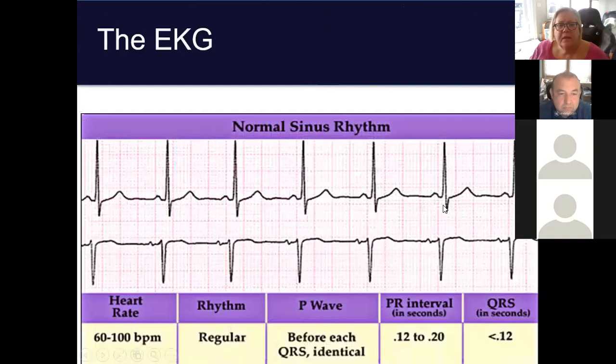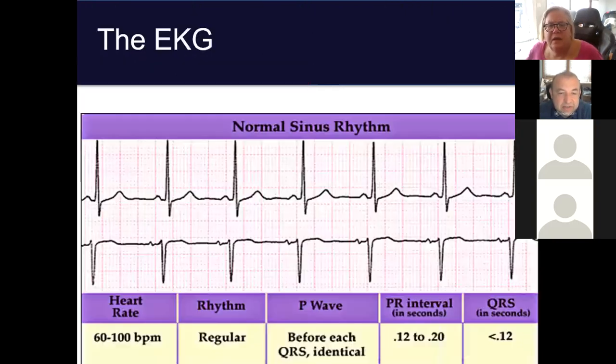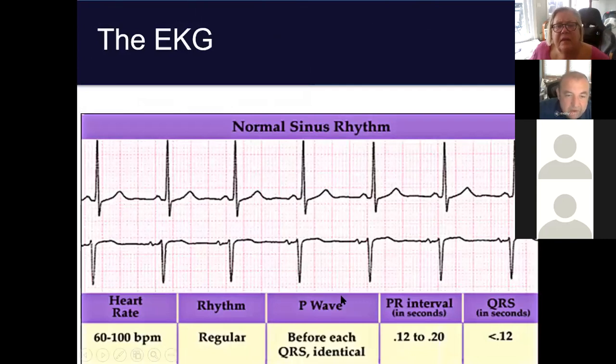All right, so here's normal sinus rhythm. Again, well, maybe that's V1. I was going to say V1, one of the V leads. Yeah, because we'll show 12 lead. We'll show our wave progression, right, Eugene, when we get to V1 through 6. Since we see a biphasic P wave, that's probably V1, because at AVR it should be completely negative, and here we see plus-minus at the P wave. Okay, that's the detail.